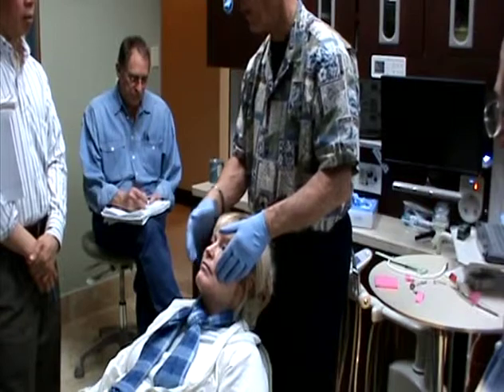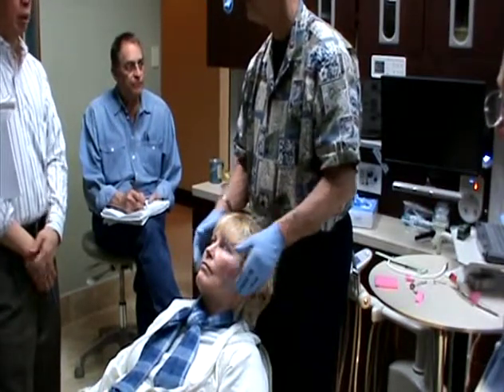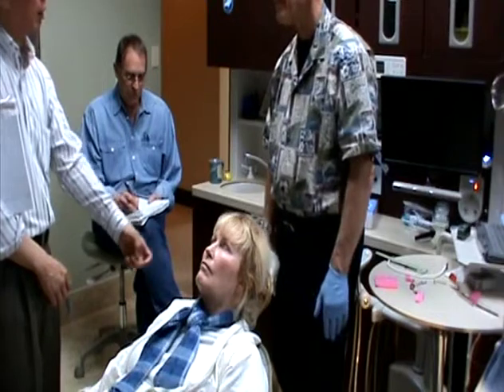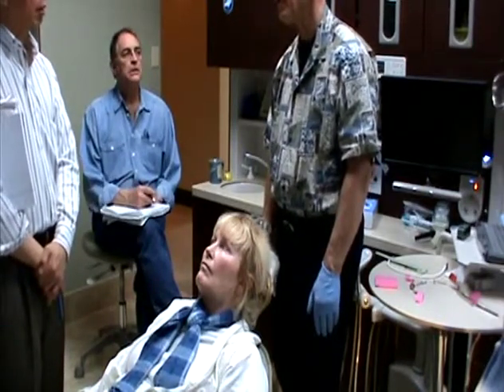But if you've got more force on the right than the left, you're going to expand the right more than the left. Right. But you have to have the through elastic in order to release the internal rotation here. So how are you going to stop this from expanding out on the lower right side? You don't use your ALF down there until you get through with the upper.